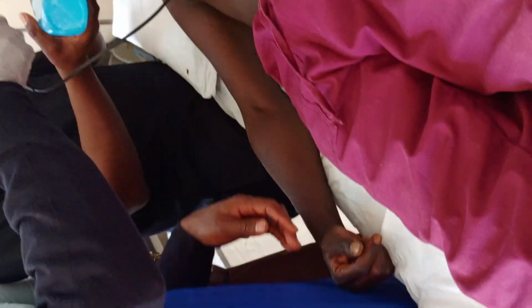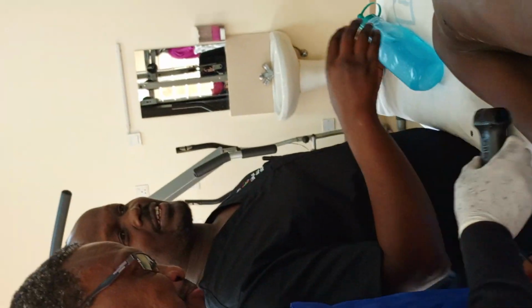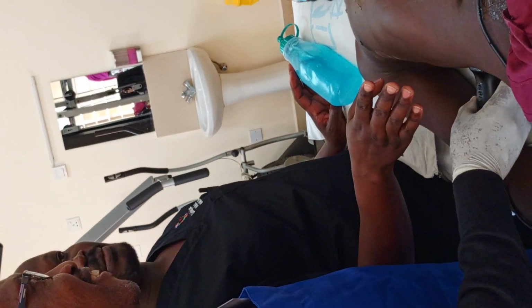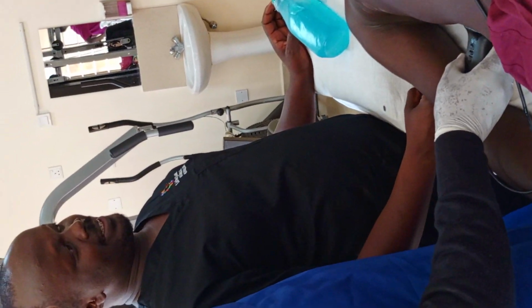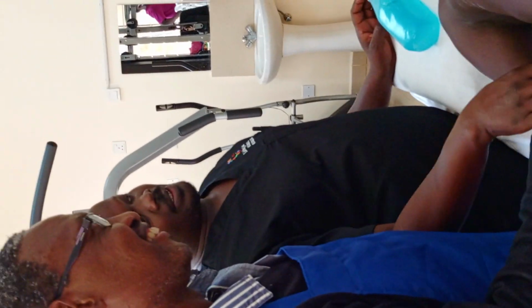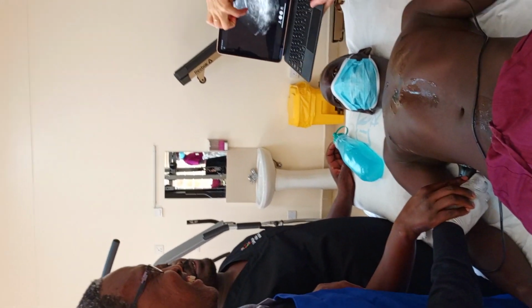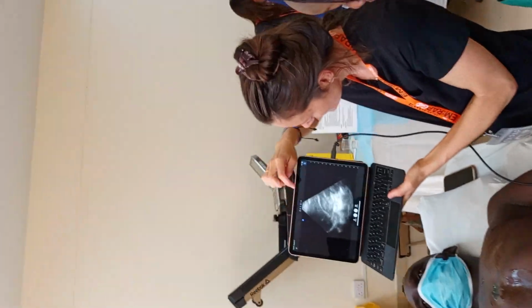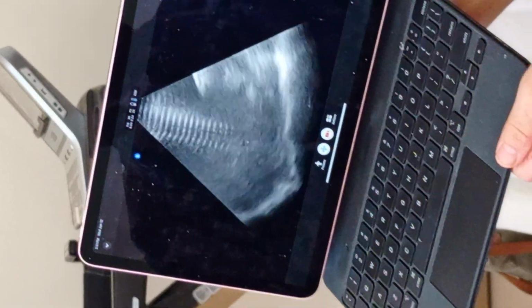Do you guys have any questions? But how much does it cost? When you use your patients in the OPD, you can see for those trauma patients. For trauma cases, just feel good about it. Go back to your view. Show it off, it was so pretty. You'll often have dressing. Oh, hello, Morrison's pouch. Beautiful view, love that. Liver, kidney. All right, subxiphoid.